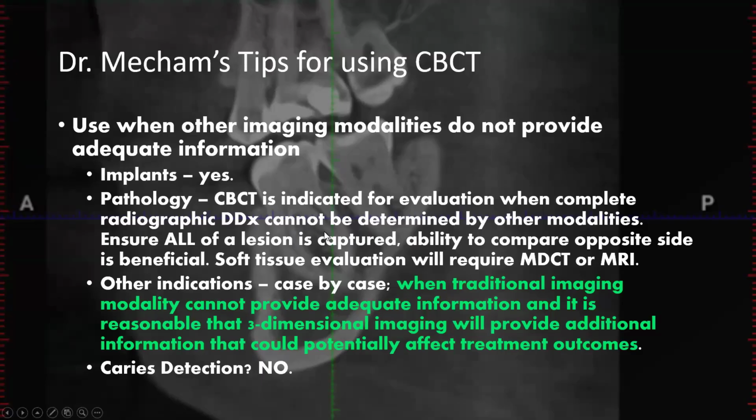I would say in most cases of cemento-osseous dysplasia as well, that's going to be more of a 2-dimensional differential diagnosis, which maybe the only thing on your differential because it just looks like it, and you've ruled out a periapical inflammatory lesion. You're just going to say, yeah, that's consistent with periapical cemento-osseous dysplasia or focal cemento-osseous dysplasia, and in those cases probably not require CBCT imaging.